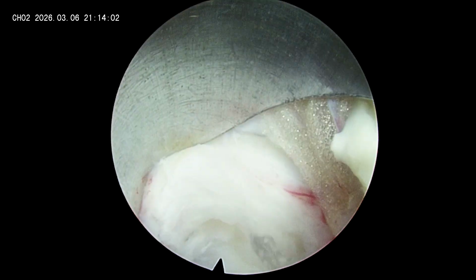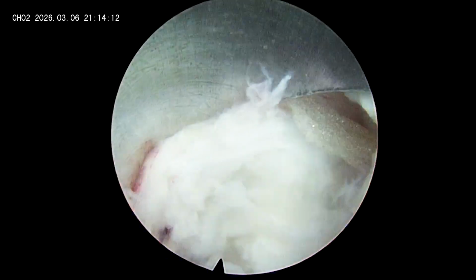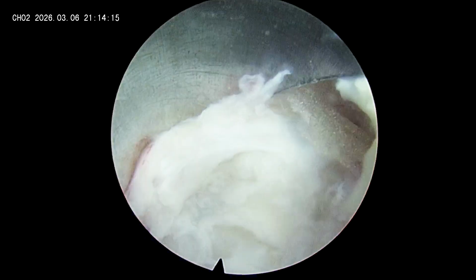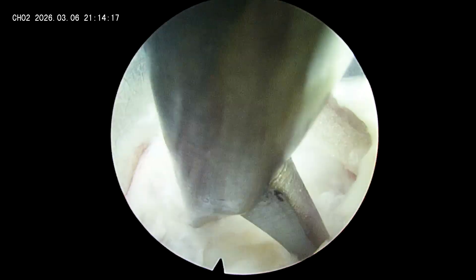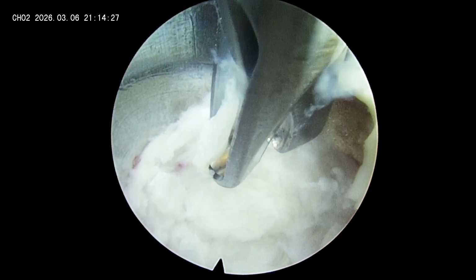If it is soft, you may not have to touch it, but if you feel it is a hard hump, then try to remove it. And one important thing while removing this hardened annulus, be careful about the retraction of the traversing nerve here. So intermittently relieve the pressure on the traversing nerve, otherwise the patient will have paresthesias.